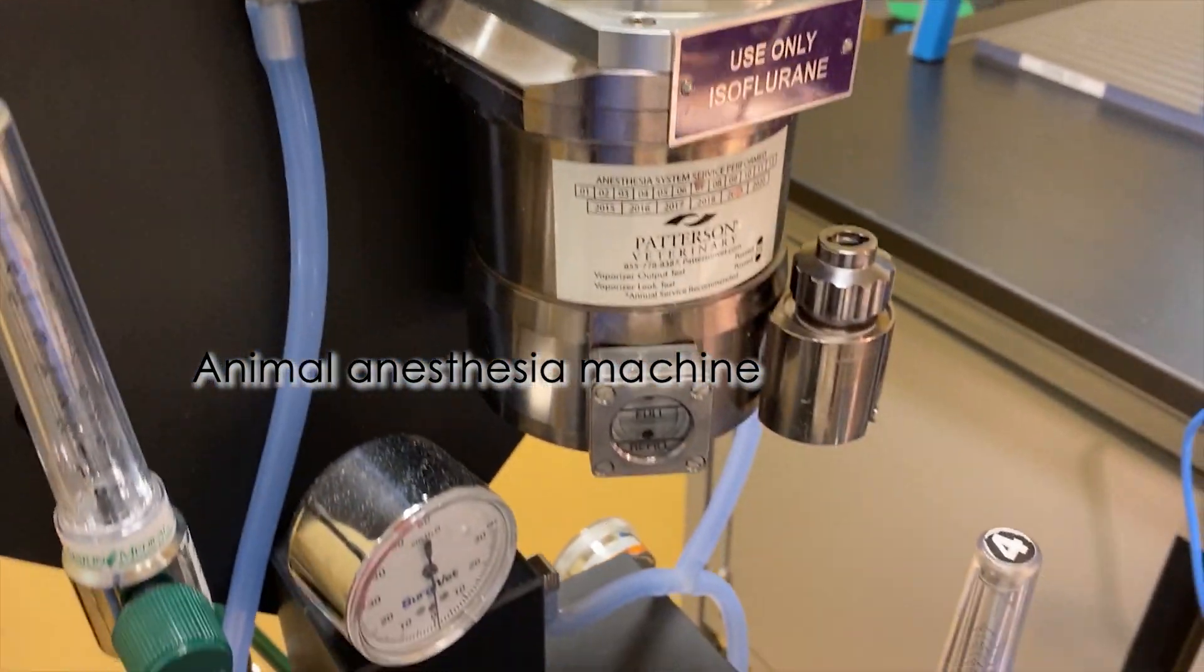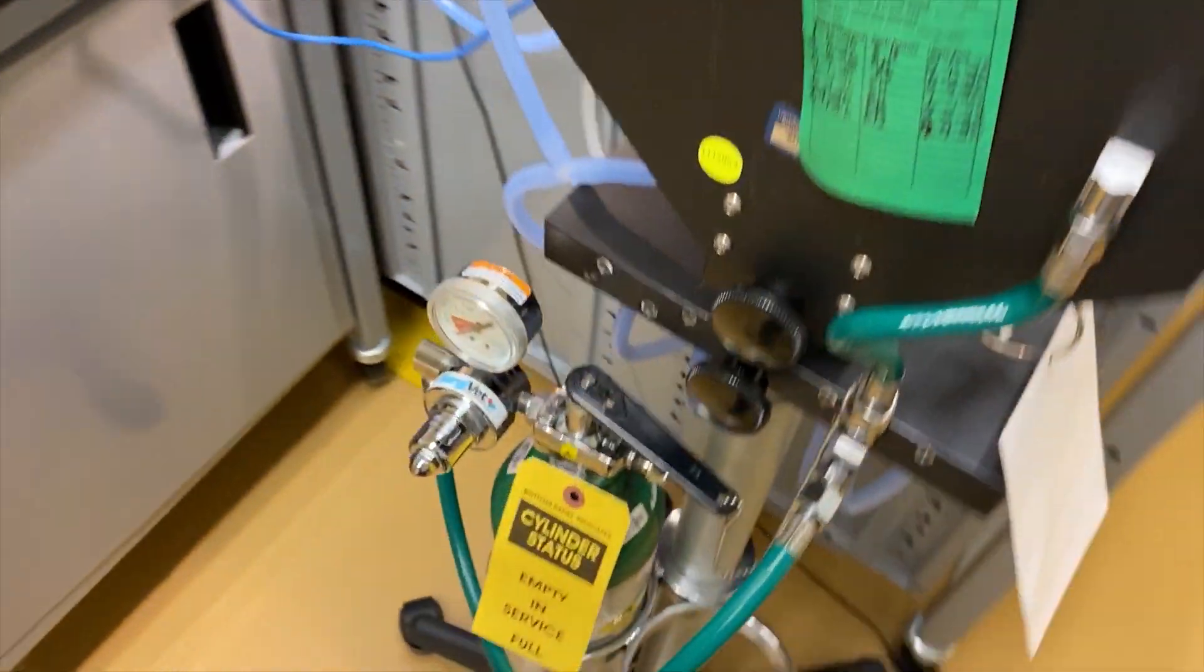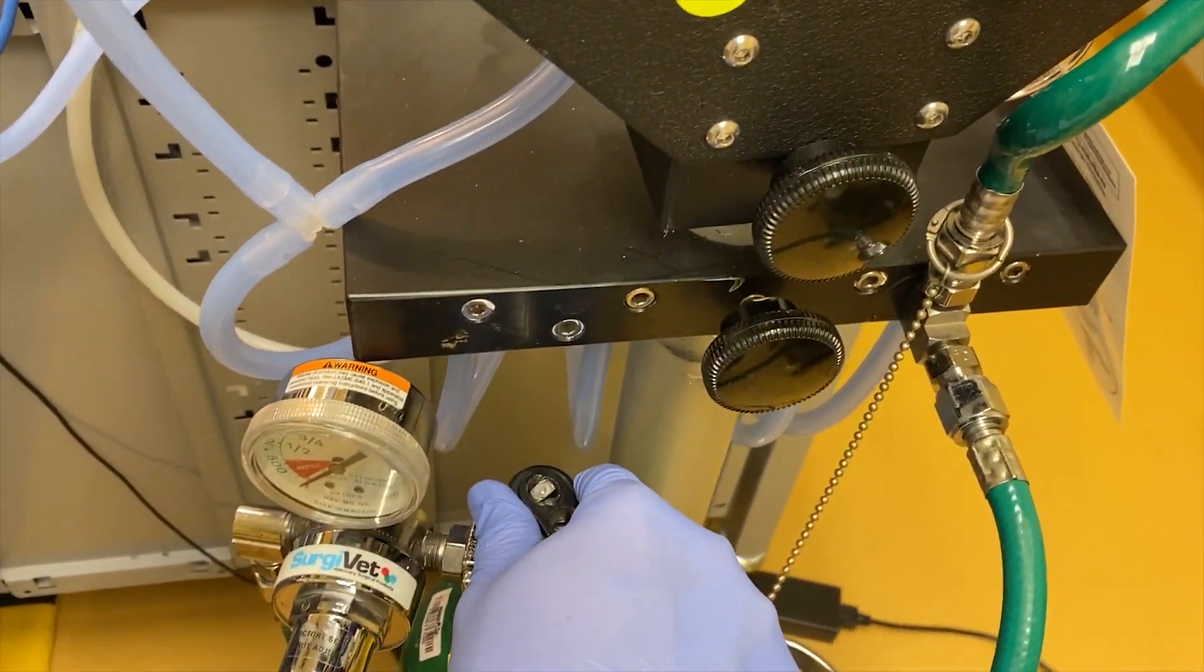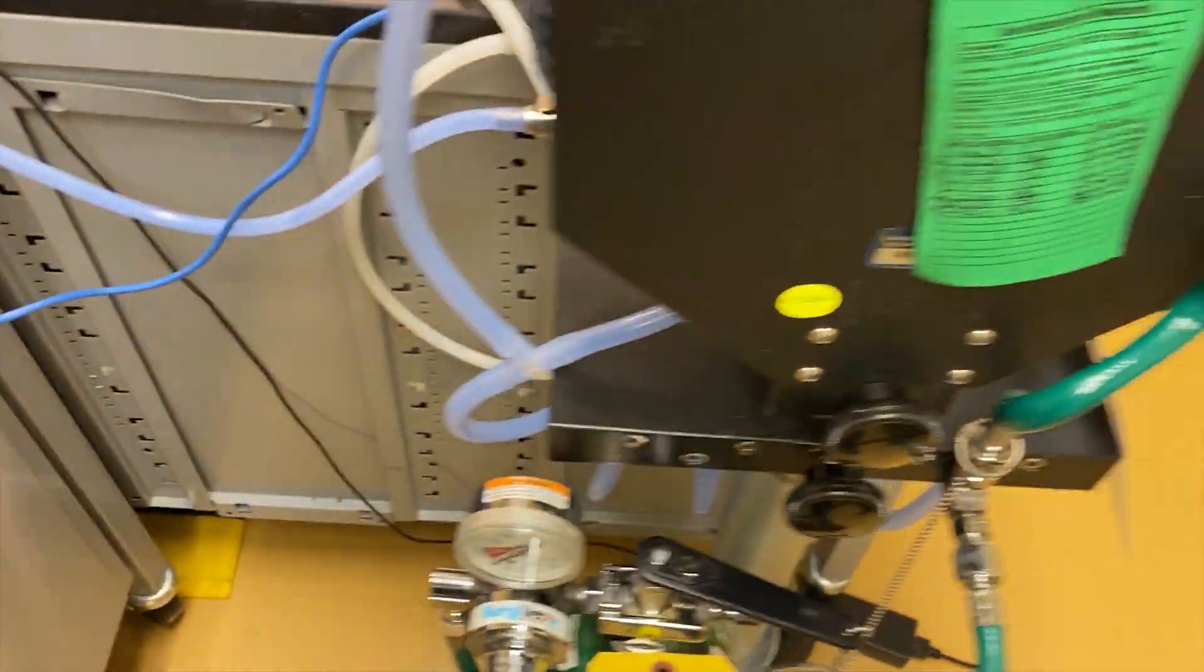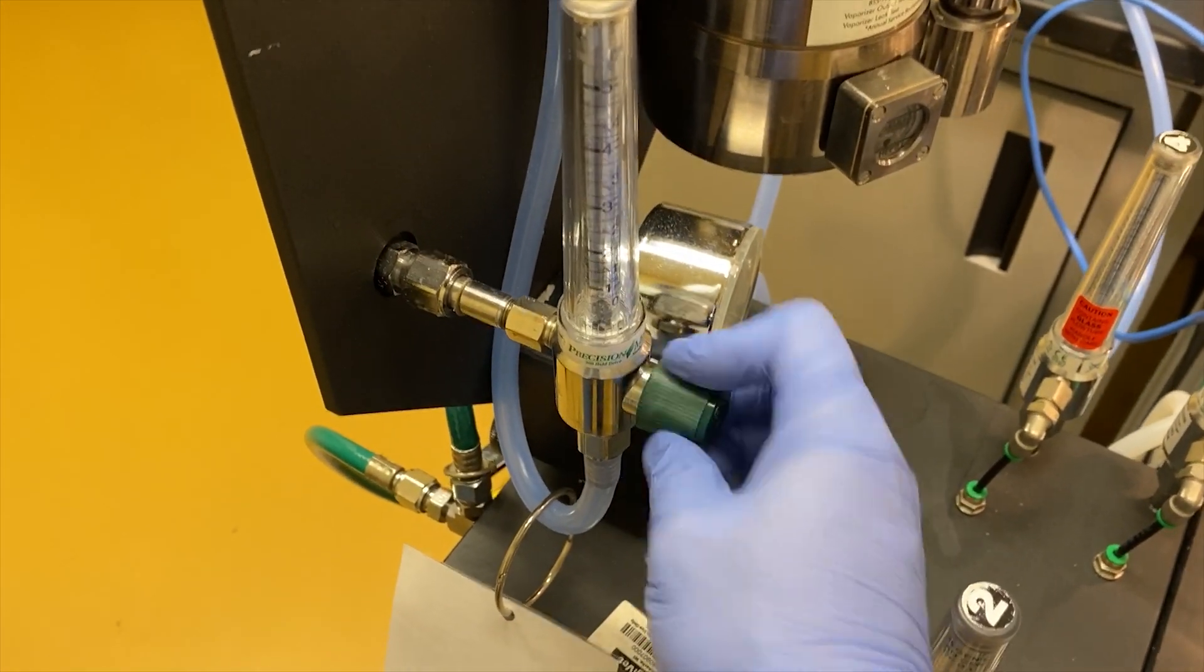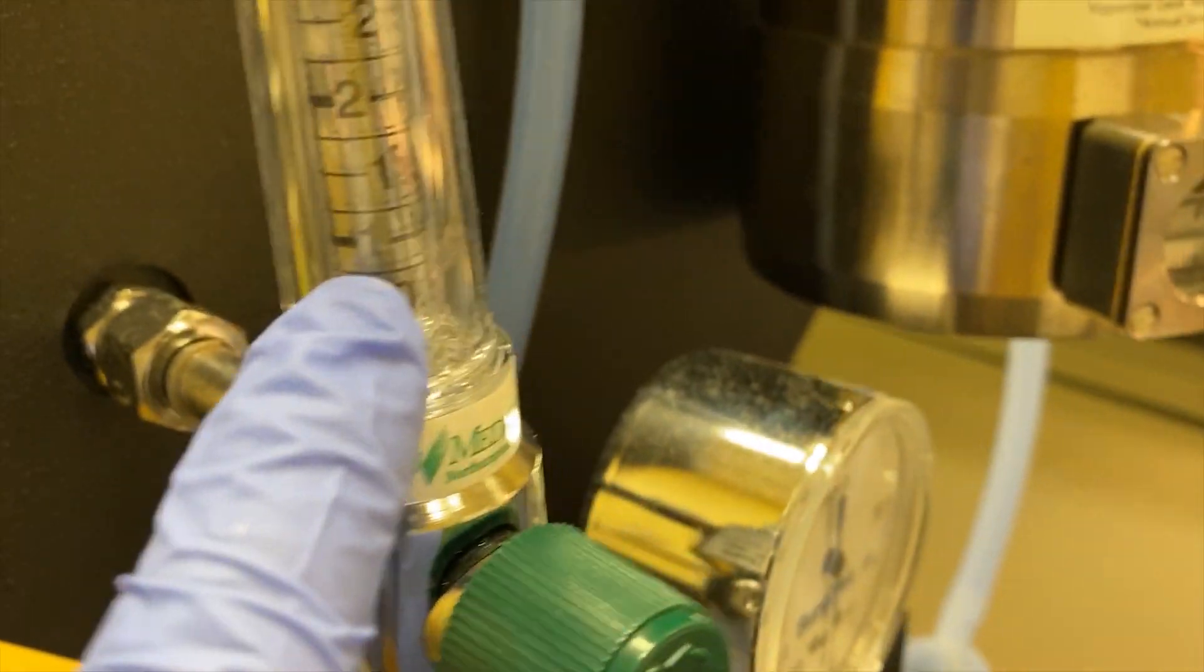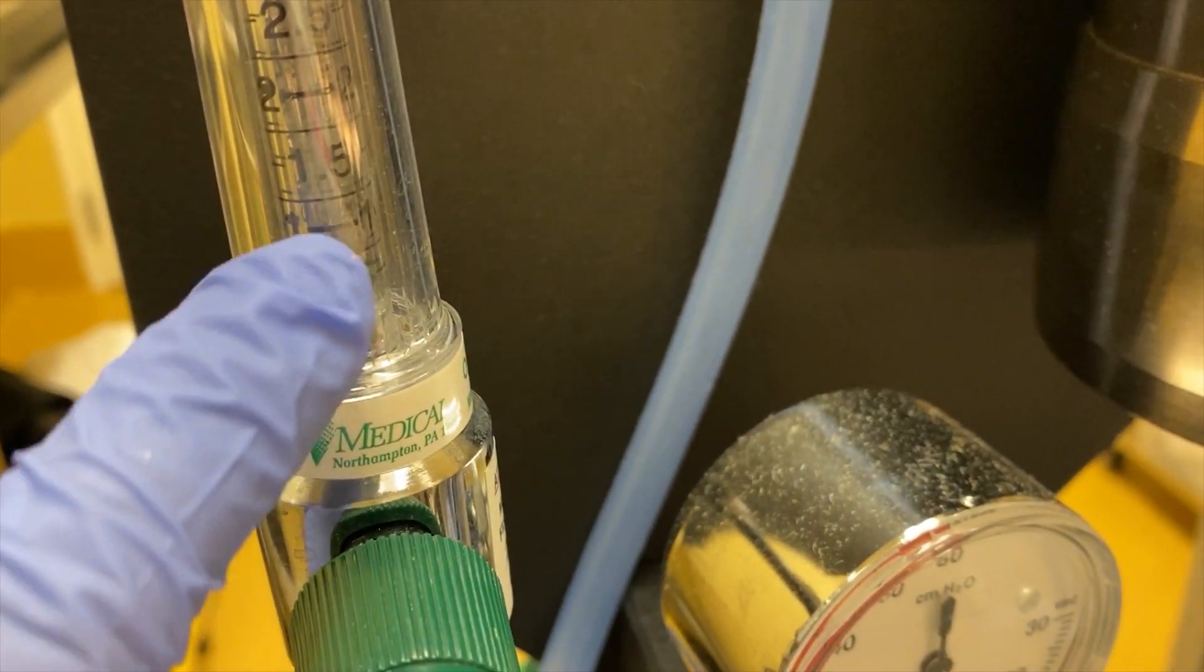So here, first it opens the oxygen tank, here, oxygen tank. And okay, it's open. And here use, so open device, put the ball to the 0.5 position, it's good, put in here.